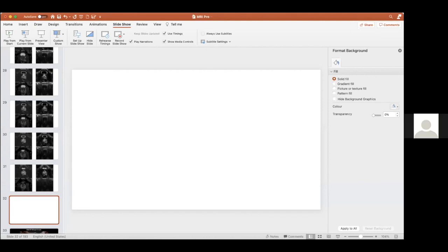We published on 200 patients comparing PSMA PET to MR on primary diagnosis, and they come out about the same. There's not that many missed by either. They're probably both about 94% or thereabouts, but they do miss different things, I think. Yep. They're complementary.